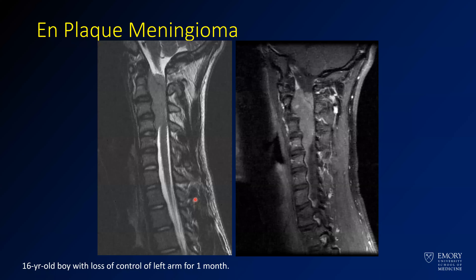This is just an example of an en plaque meningioma — a long-segment lesion where you can see the dura coming through and it's kind of expanding the spinal canal.